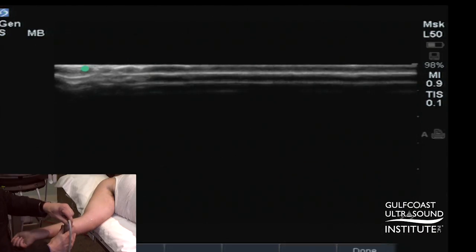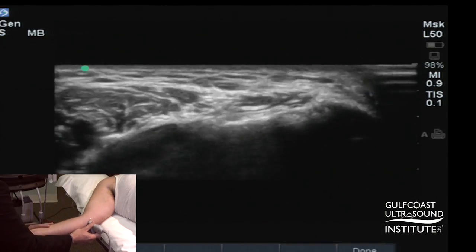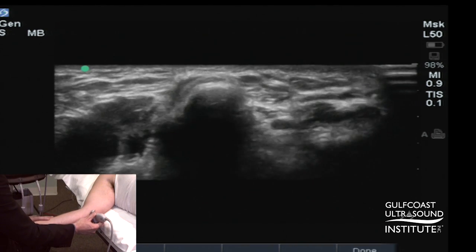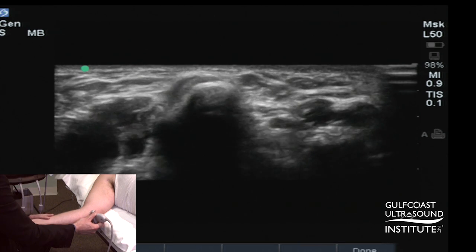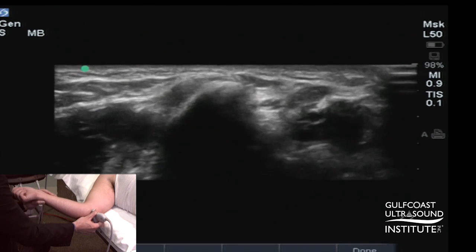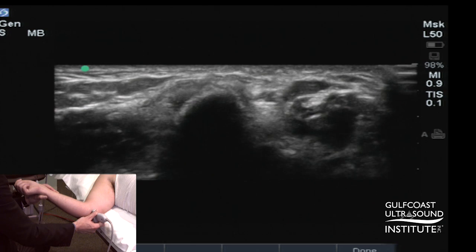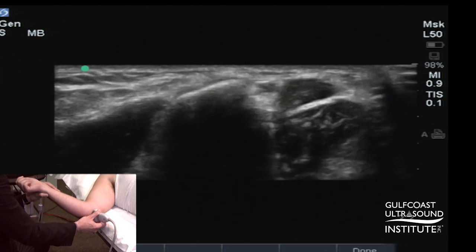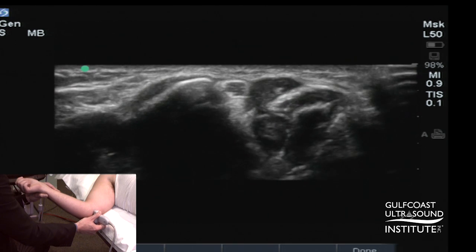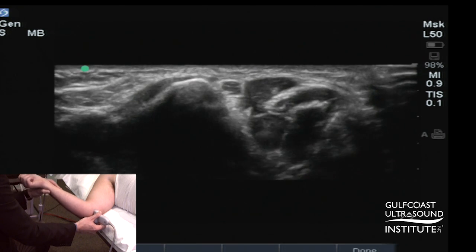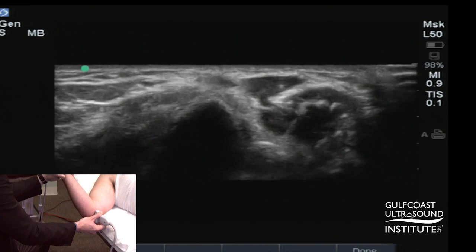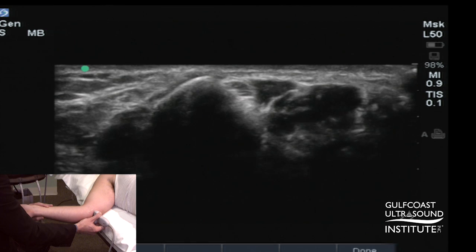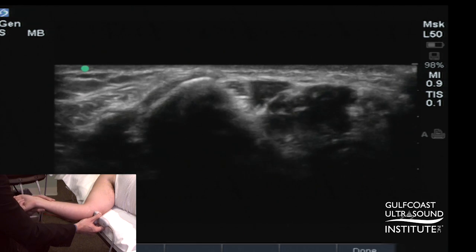Lastly, we'll look dynamically at the cubital tunnel region. We'll again identify the medial epicondyle apex as a bone landmark. I'll then passively flex the patient's elbow, and the key is to keep this bone landmark in view. If I lose the bone landmark, I stop moving the patient, reposition the transducer to get the landmark back, then continue movement. I'll do this passively back and forth to make sure I'm able to keep the transducer on this important bone landmark.